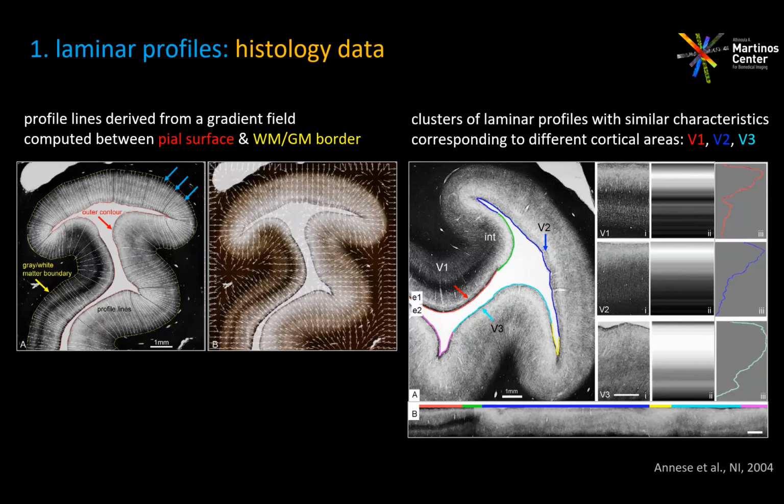But let's move on to the MRI world. I just want to point out that I'm not trying to argue with Farouk on the laminar versus cortical depth profiles. I do prefer the cortical depth term because we're not trying to refer directly to the anatomical layers. Our resolution is still not quite on that level, but we are talking about depths in terms of percentage of the cortical thickness. So they're relative, right? They're not distances in millimeters, if that makes sense. We can talk to Farouk in a coffee break about it.